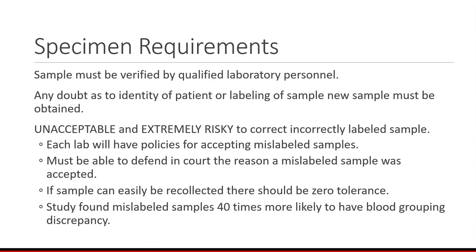A study found mislabeled samples are 40 times more likely to have a blood grouping discrepancy, which means the types don't match.